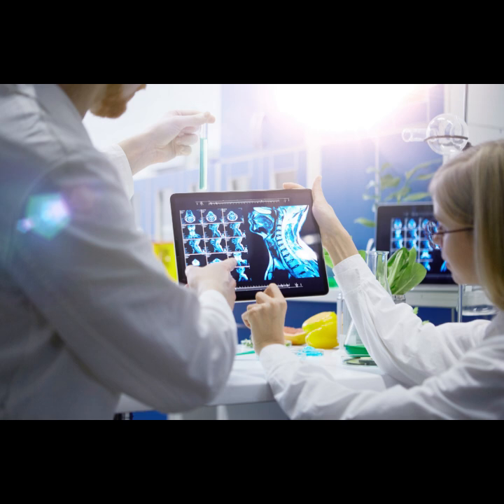Got it. And the third one, spiral imaging. Spiral is cool. After one excitation, you use smoothly varying gradients to trace a continuous spiral path outwards from the center of k-space. Covering low and high frequencies relatively quickly in one shot. Exactly. It's often a single-shot technique, making it very fast. And because it covers the periphery well, it can achieve good resolution efficiently. The sources highlighted a hardware benefit too, easier on the gradients. That's a key practical advantage.